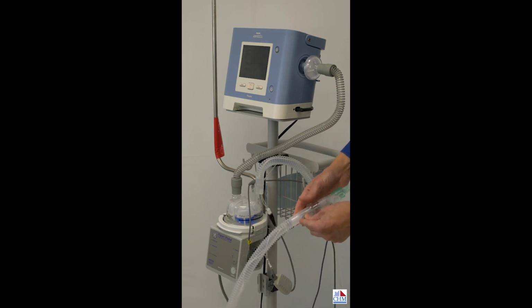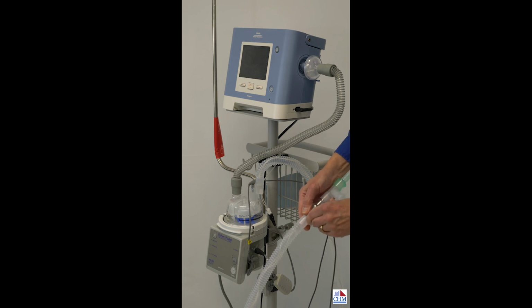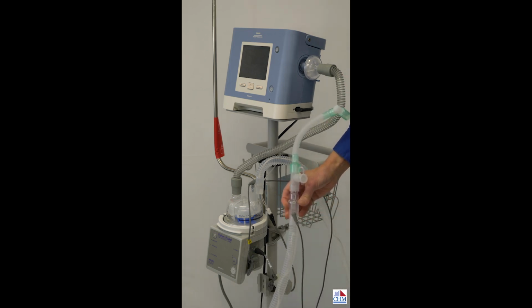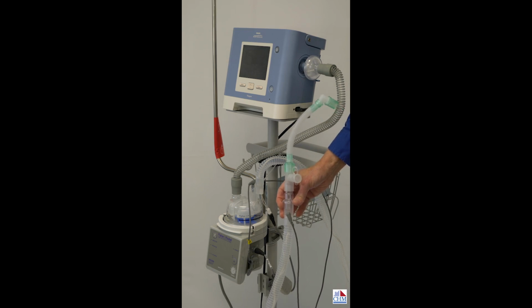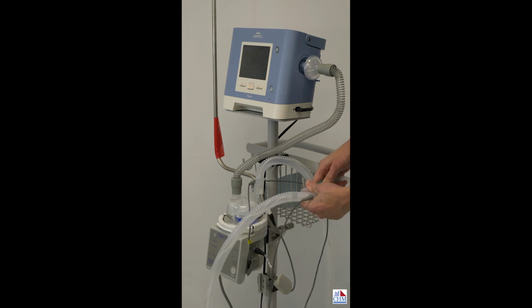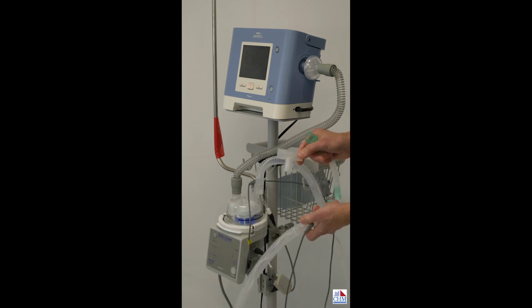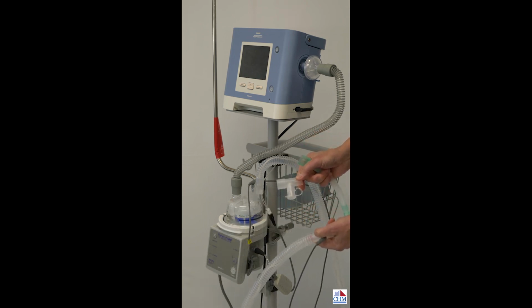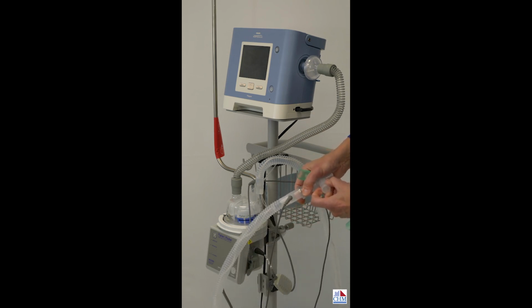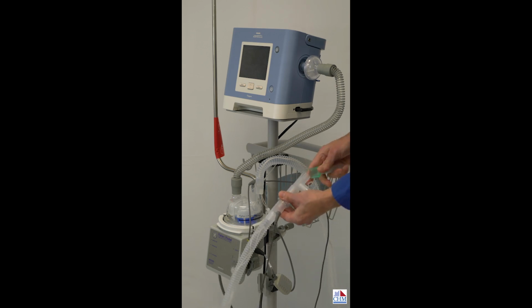Then we've got our temperature probe to fill that spot, and that's where it monitors the temperature right up proximal to the patient. And then I've also added in here an adapter, which you may not have, but this is a nebulizer adapter. This is a spring adapter so that I can take this off and insert a nebulizer into this portion to give a neb treatment. You may not have that in your circuit, but it's pretty common to have.